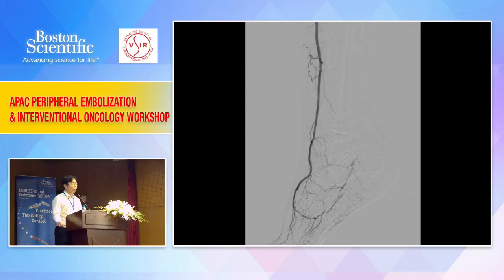And in this angiogram with the catheter going past the area of the occluded segment, you do a lower angiogram, and you know that this patient's main vessel runoff is only via the anterior tibial artery, because you can see that the arches of the foot are well formed.